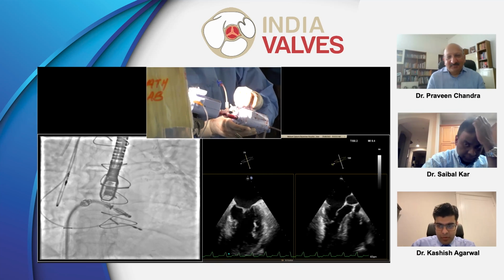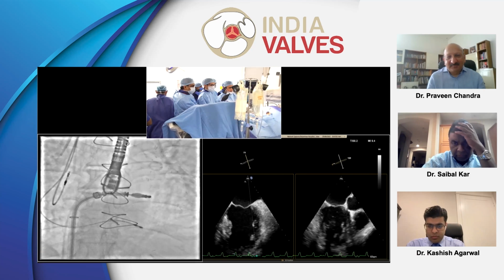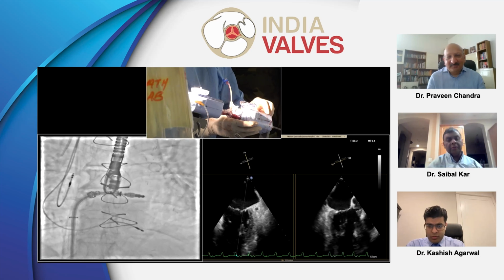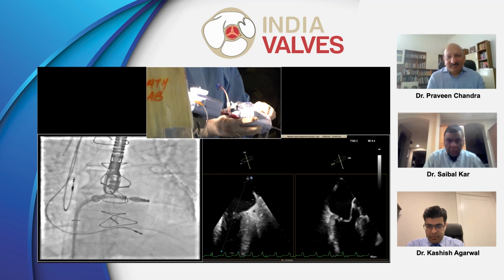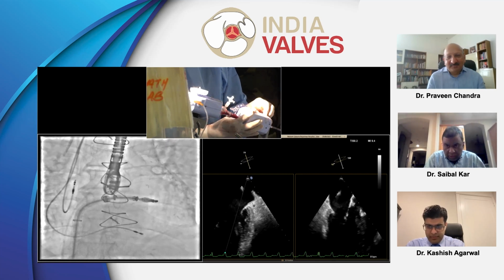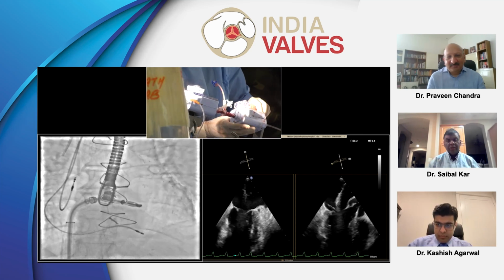Okay. Go anterior. Okay. You're very far inside. Yeah. Bring your weight posterior. So I'm going to come anterior. Yeah, okay, so good. So come back. I came anterior. Very good. Okay, great. Now open the clip.